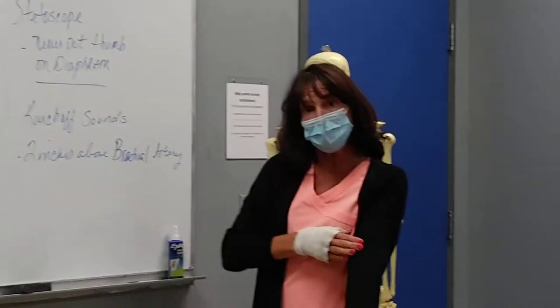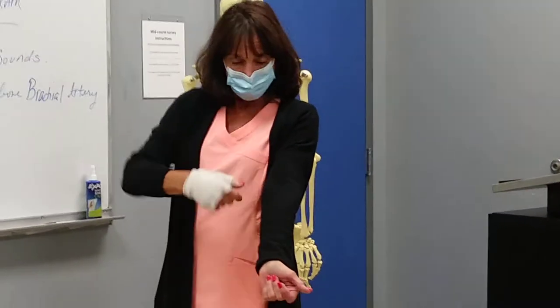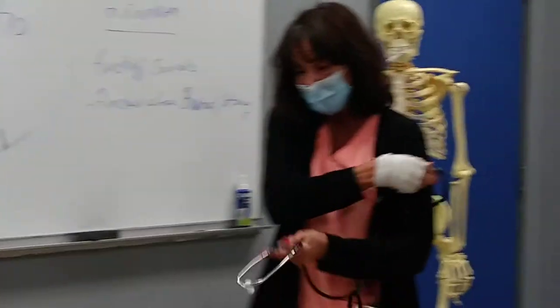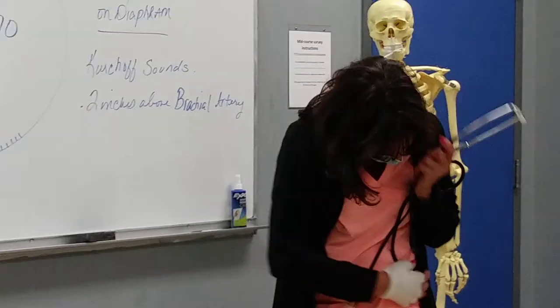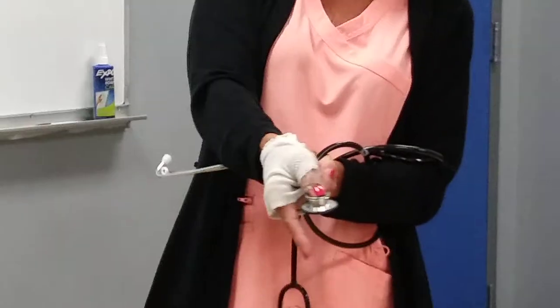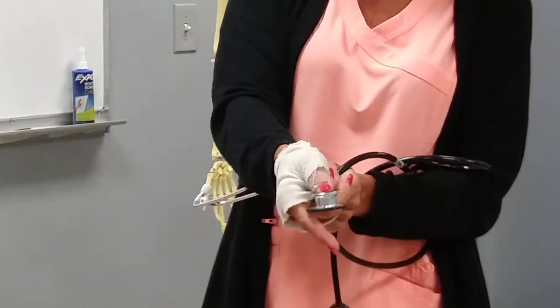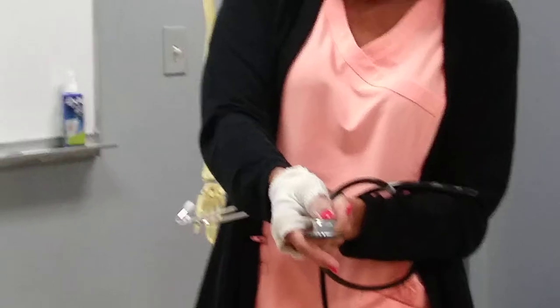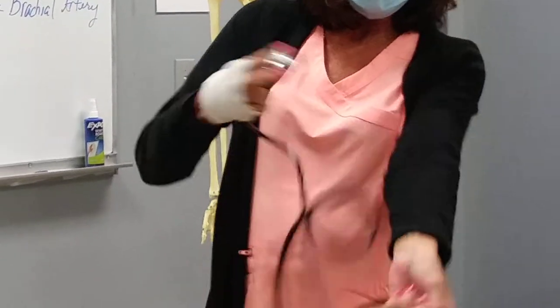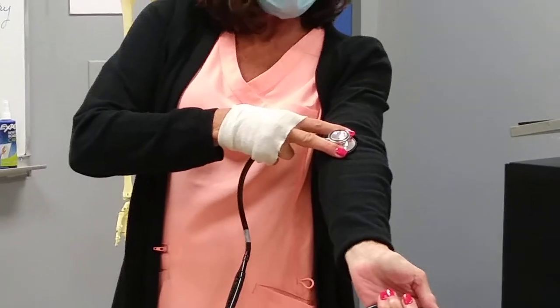So what you're going to do is feel for the brachial pulse, and you're going to set your stethoscope over it, not putting your thumb directly on the diaphragm here. Not putting your finger directly over the bell, just like this, because you'll hear sounds from your thumb. So you want to actually take your fingers and lie flat against the brachial artery.